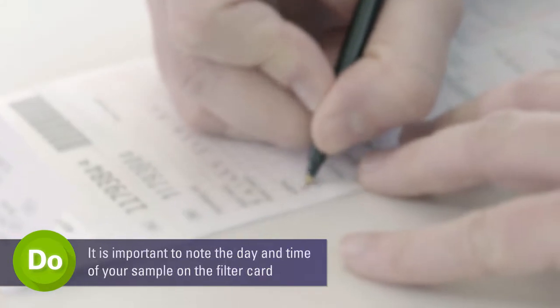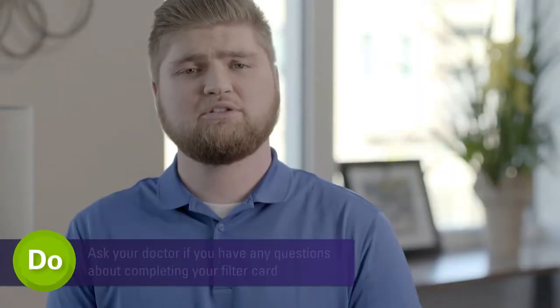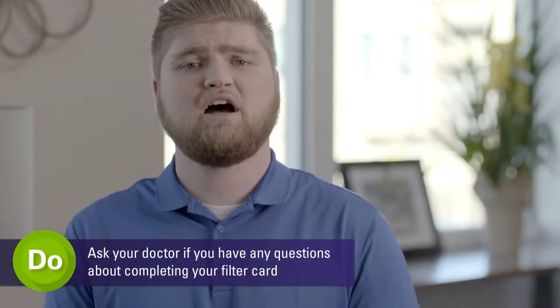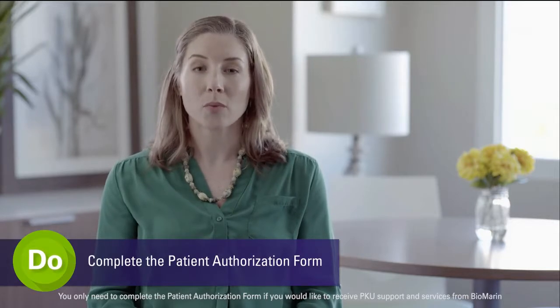It is important to note the day and time of your sample on your filter card. Completing the personal information on your filter card prior to testing minimizes the handling of the filter card and personal contamination of your test results. You will also need to complete your patient authorization form, which gives Biomarin permission to contact you for support purposes.